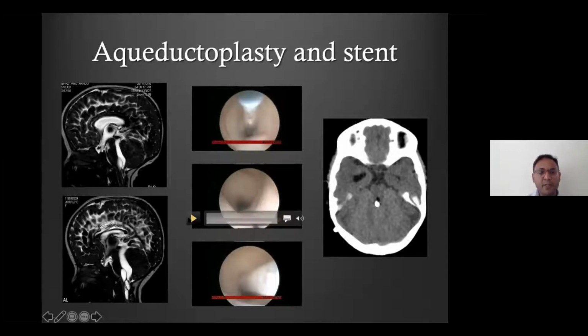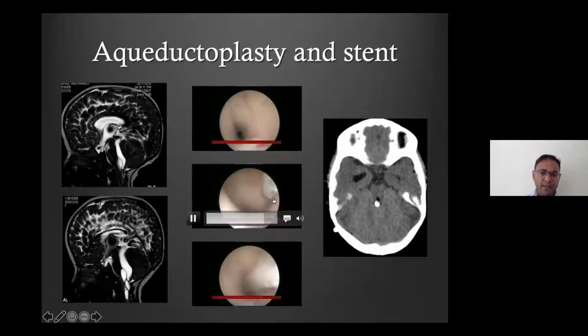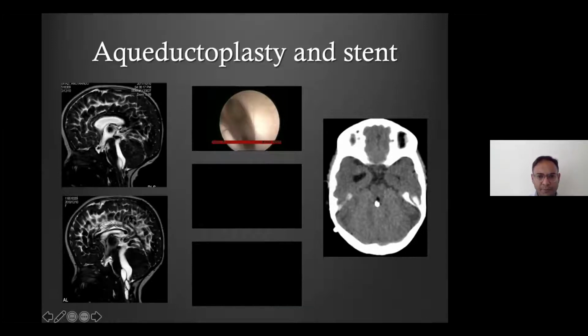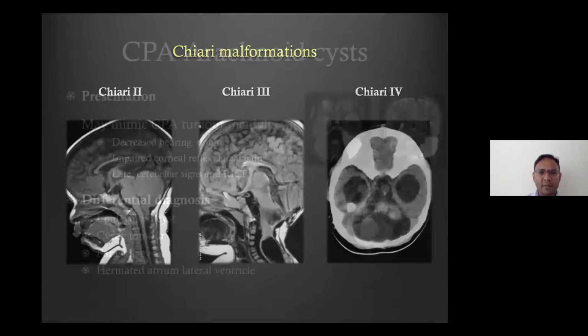And it would be interesting to hear afterwards. But for these fourth ventricle cysts, we often approach them supratentorially. And I'll just play all of these. And at the same time, you can see the steps from 1 to 2, placing the stent under endoscopic guide. The last one here with the stent anchored. So we then anchored the stent supratentorially within an Ommaya reservoir. The Chiari malformations, one's got to mention them in this differential 2, 3, and 4. I think they're fairly distinct, but you often need to bear that in mind because of how dramatically the treatment differs.